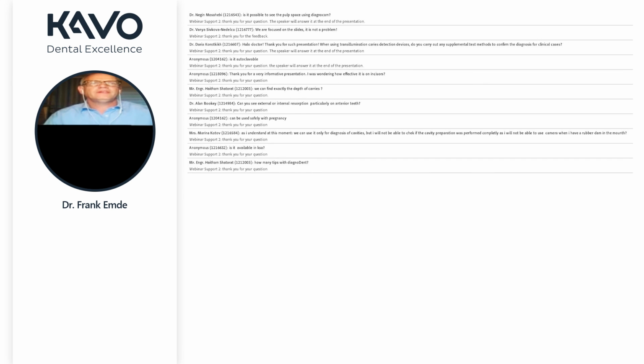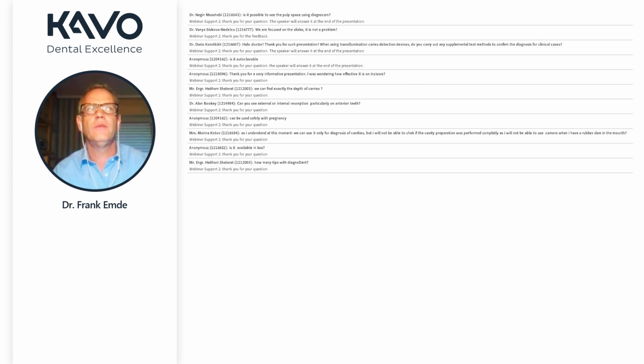Can we find the exact depth of caries? Yes, this has been confirmed by some studies. These studies confirmed that the enamel lesion always corresponds to the size you can see with the Diagnostic, and the clinical situation. There was a study in Munich where they investigated this intensively. There were some signs from the literature that there's no correlation, but we could clearly show with different studies that the size of the lesion always corresponds with the size inside the tooth. As I said, dentin, we are not able to look inside.